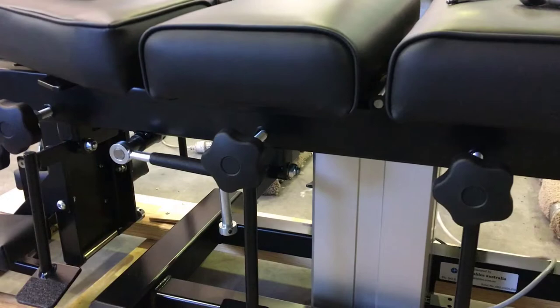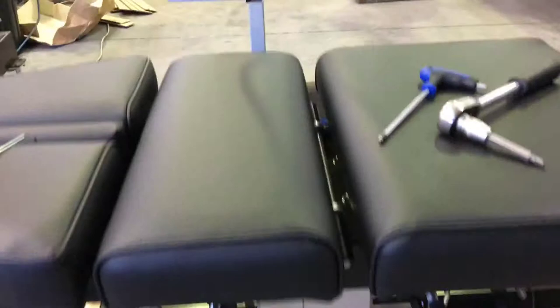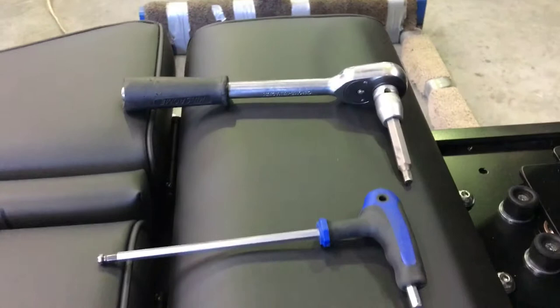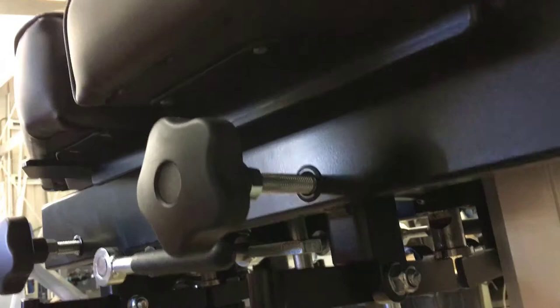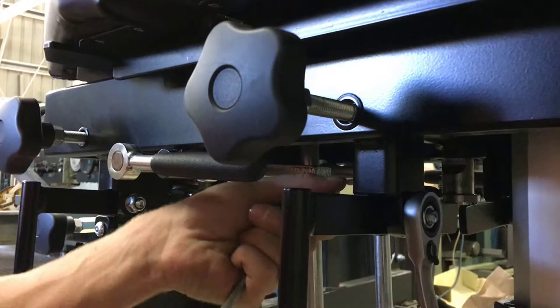Replacing pedals is quite easy — just work on both sides simultaneously holding all the nuts and washers. If the table has been stationary for some time, you might find it difficult to remove the nuts and bolts, so use a longer leverage device to give you a better chance of removing them easily. You can remove the spring or, honestly, I leave the spring on and take the pedal out. Lock one side and use a ratchet on the other — you'll want an 18mm ratchet or spanner.